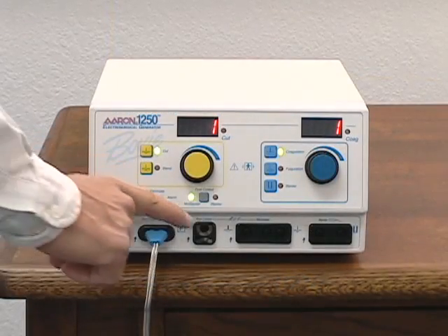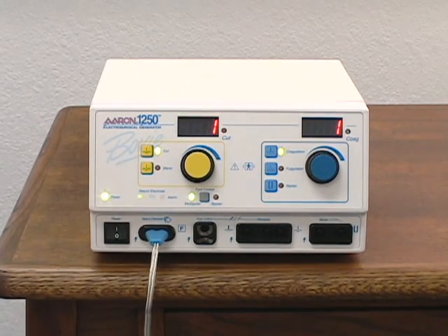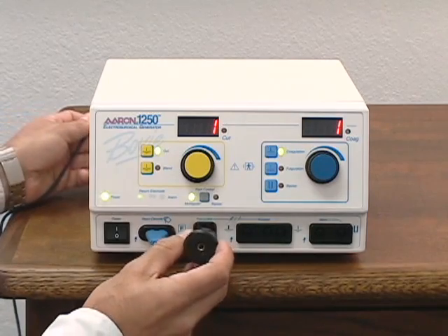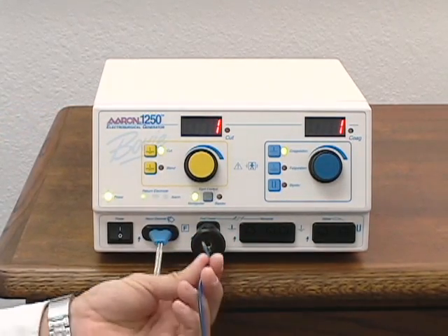The foot control output receptacle accepts the standard Bovie number 12 plug. Some accessories, such as foot control pencils, Bugbee electrode, snares, and certain arthroscopic and endoscopic instruments, may have cables that require the use of an adapter. To use the optional adapter, plug the adapter into the receptacle marked foot control, then plug the accessory into the hole and tighten the locking screw.